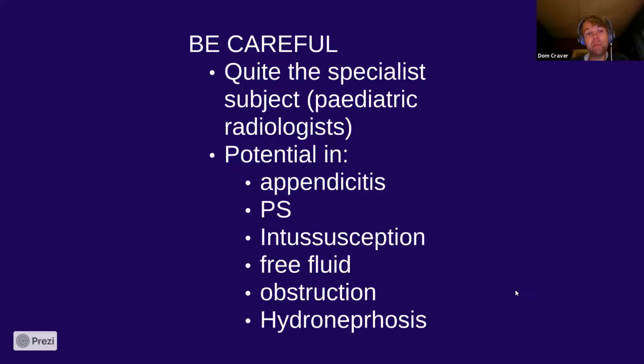Looking for free fluid. Be a bit careful with free fluid because when kids have got a bit of a tummy upset, they can have little bits of physiological fluid, normally with gastroenteritis. So just be careful with that. Obstruction. I think we've had a case before with backflow and things like hydronephrosis. There's loads and loads of possibilities. I'm just going to cover a couple of them in this talk.